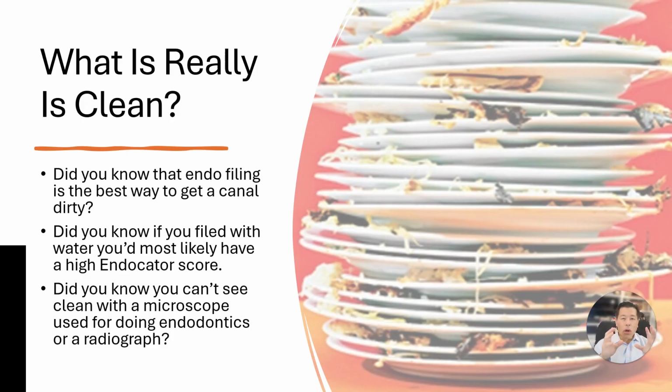So a lot of us, and I was of this thinking too, thought that when I'm using my mechanical files, I'm really doing the cleaning. I'm removing the tissue, I'm removing the bacteria. Oh, and then I'm also shaping the canal so I can obturate. But as I use that mechanical file, how do I know that I've gotten that bacteria down below a level where the body can then heal itself? Did you know as I use that file, I'm creating a lot of dentinal mud. I'm mixing the bacteria with the blood that could be in there, with the purulence that could be there, and it's all becoming one kind of cloudy mass within the canal.